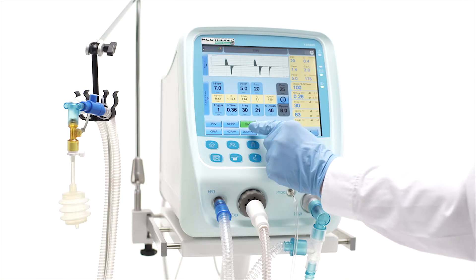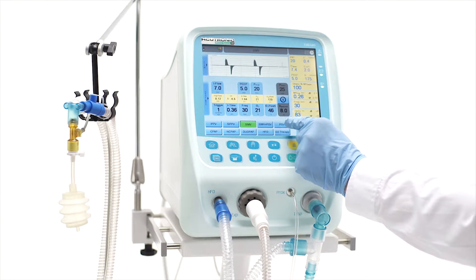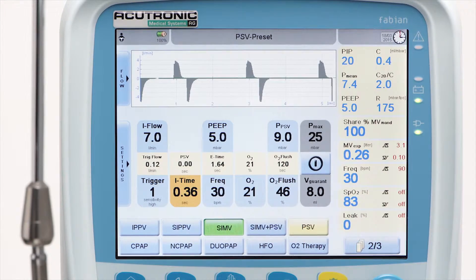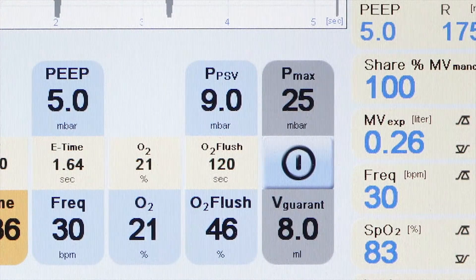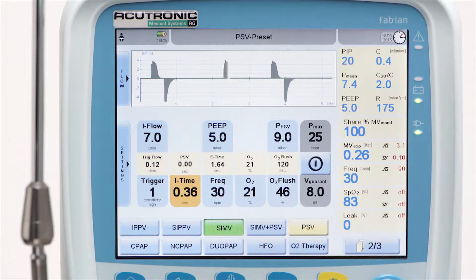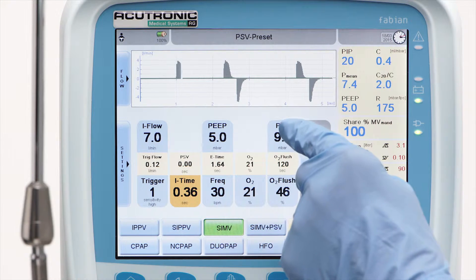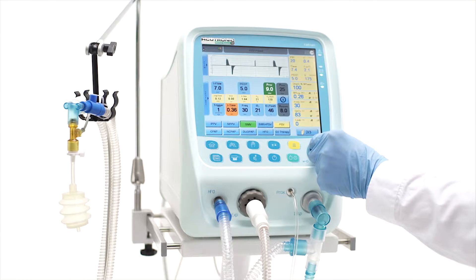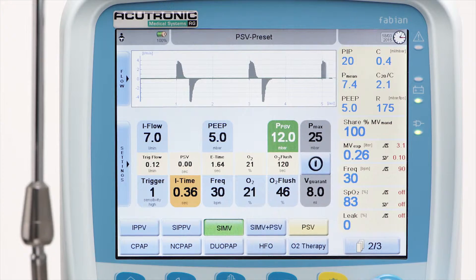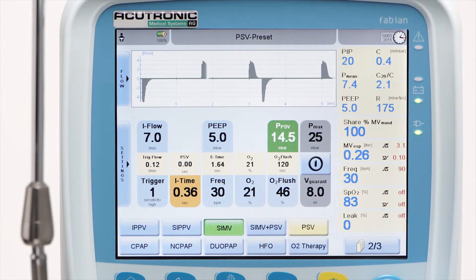In pressure support ventilation, PSV, the spontaneous breathing is assisted by the ventilator at the pressure level set with PPSV. The lowest possible level of PSV is 2 cm of water above the PEEP level, and if set as low as this, may act as an ET tube resistance compensation.